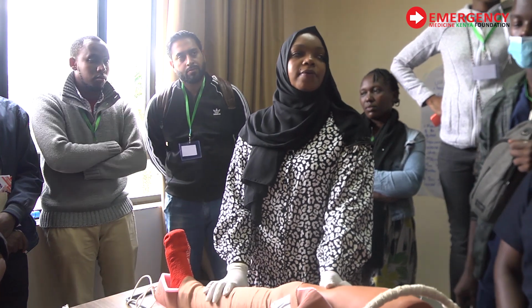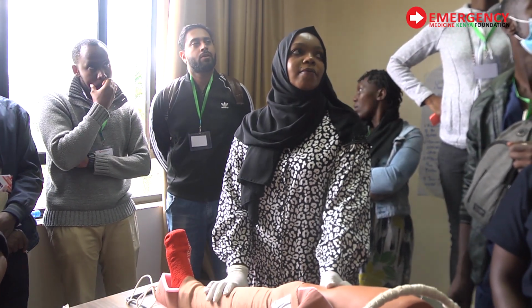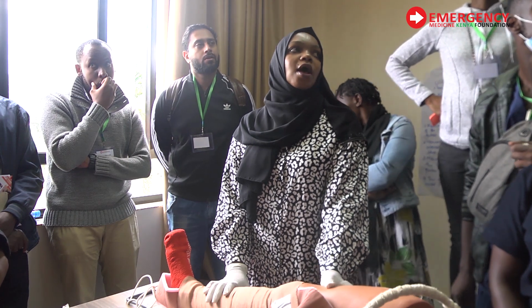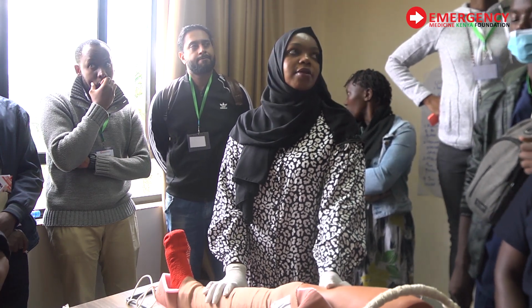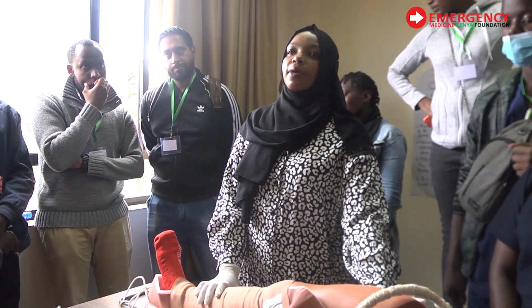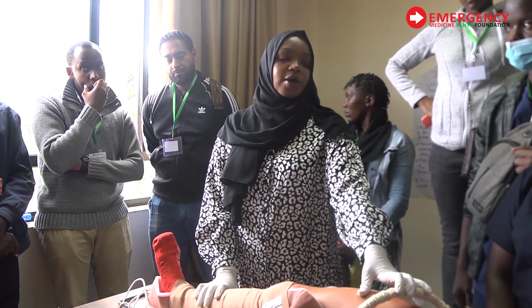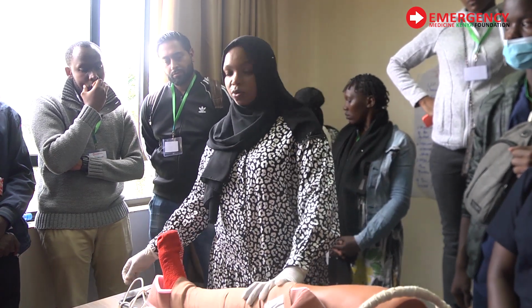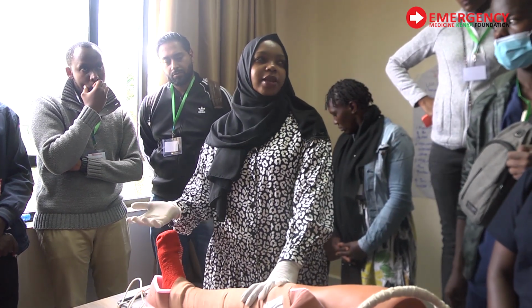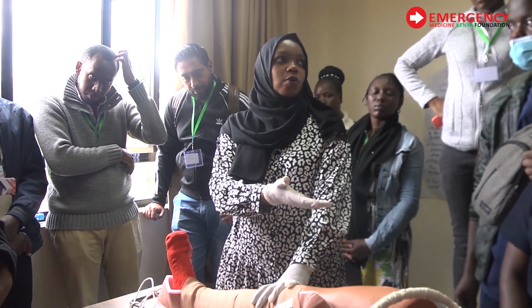Will it be steady enough even if you need to move the patient? Yes, you will. But if you're moving the patient to an ambulance, obviously you remove the Thomas splint, and you also disconnect your skin traction. I think it's something like 10-15 minutes. And then once you put him in the ambulance, you reinsert your Thomas splint.